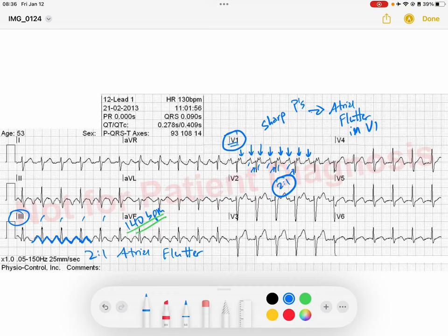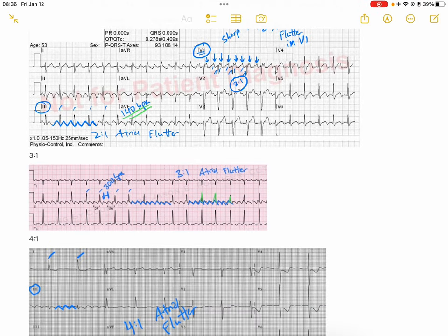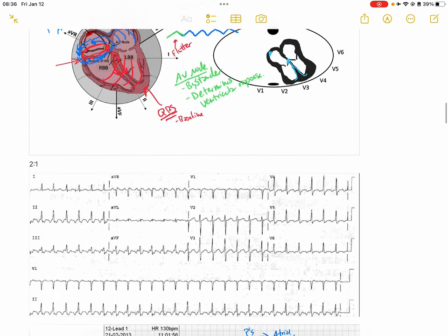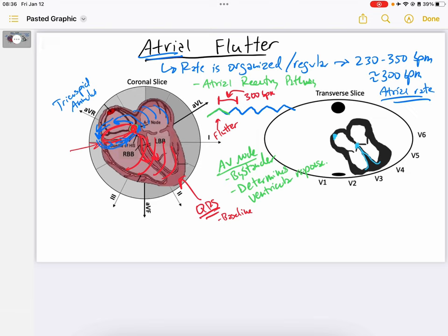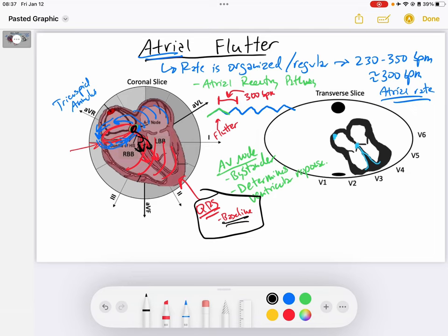I'll be posting more videos on atrial flutter, including how to determine the direction of the reentry pathway. I hope this helps you understand the physiology behind atrial flutter and why we see that baseline sawtooth pattern from the reentry circuit. Remember that in atrial flutter, QRS morphology is going to be the same as baseline — so if somebody has a baseline left bundle branch block, the AV node will conduct it in that left bundle branch morphology. Looking at prior EKGs of the individual can help you work through that clinically. Hope this helps — have a great day.